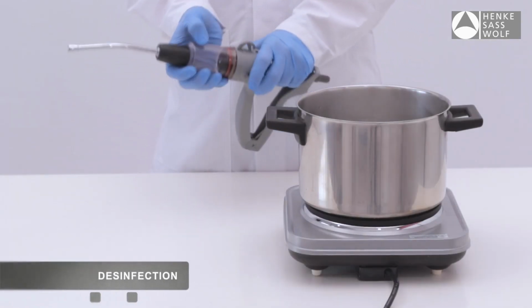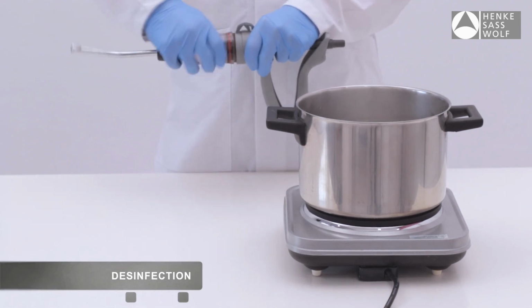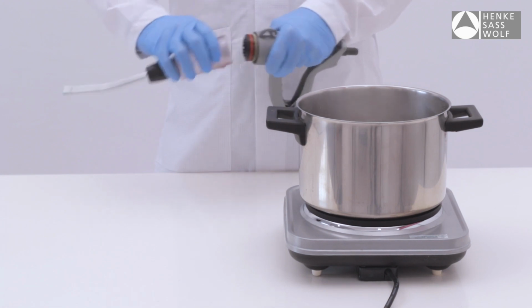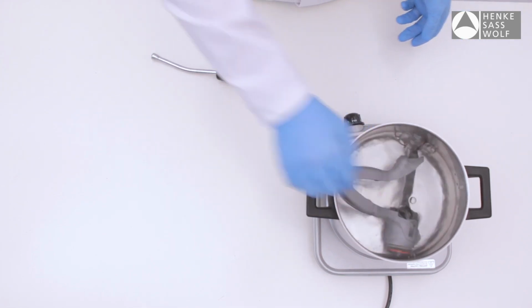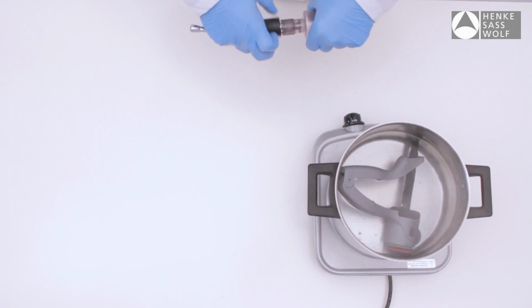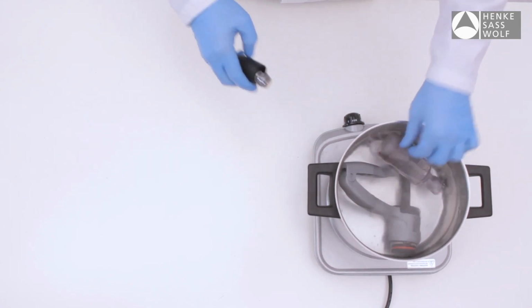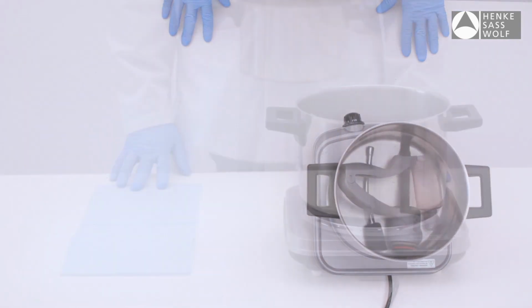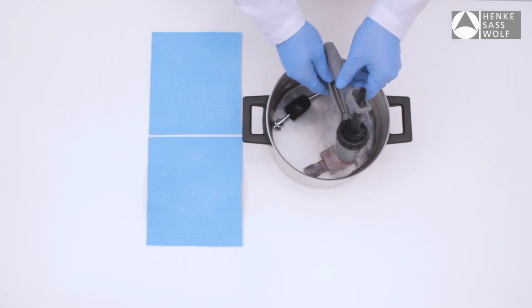It is recommended to disinfect the HSW Eco Matic and accessories before and after each use. Suspend the HSW Eco Matic Drencher and accessories used for application of solutions in a container of water and boil for at least 20 minutes. Remove the drench gun from the container and let it dry.